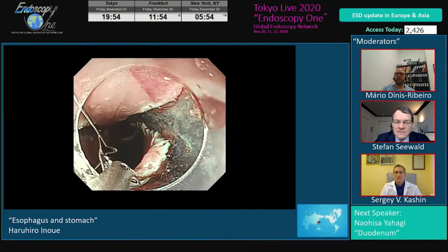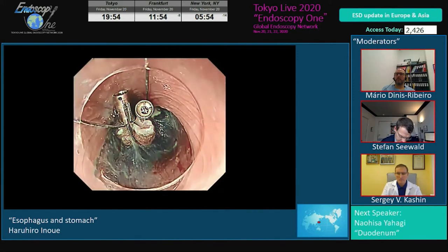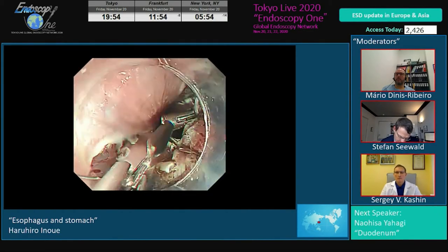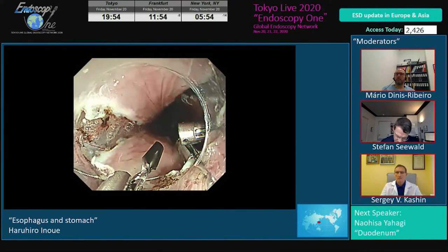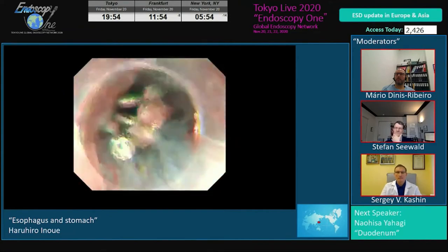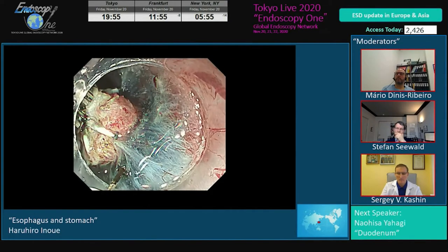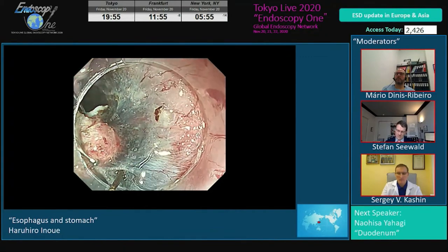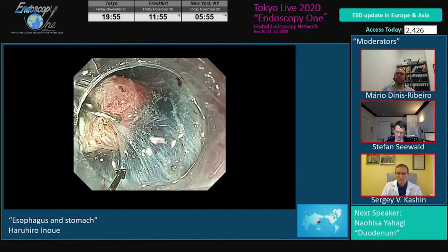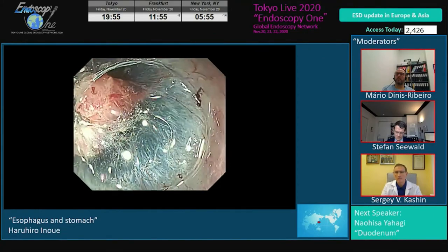Now we place it accurately onto the right wing. We can already keep a good tension. The third one is a left wing. So this multi-point traction technique rolls up the bilateral edges of the specimen toward the luminal side. Then we can keep a good tension to the tissue like this, and the specimen itself rolls and becomes compact. Then submucosal dissection becomes much faster and safer because the submucosal space itself is already widened.